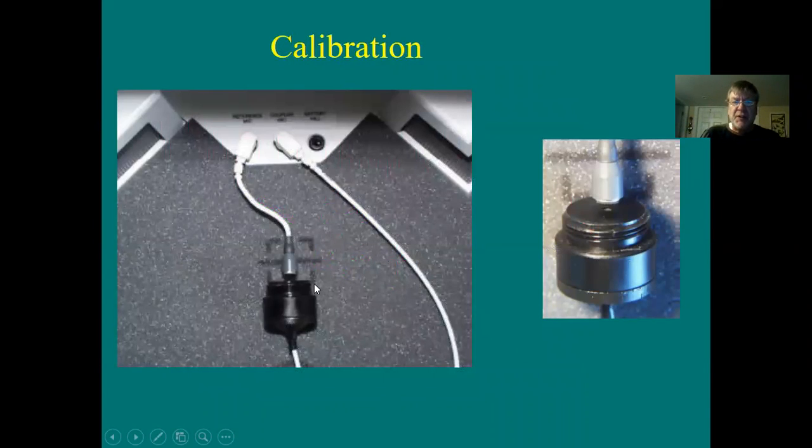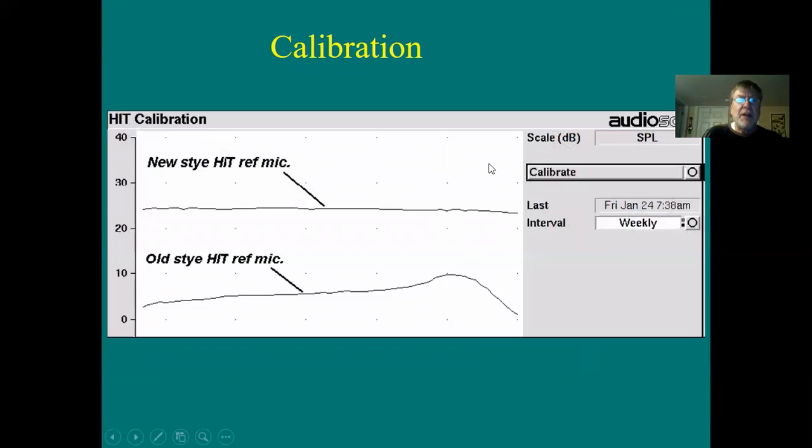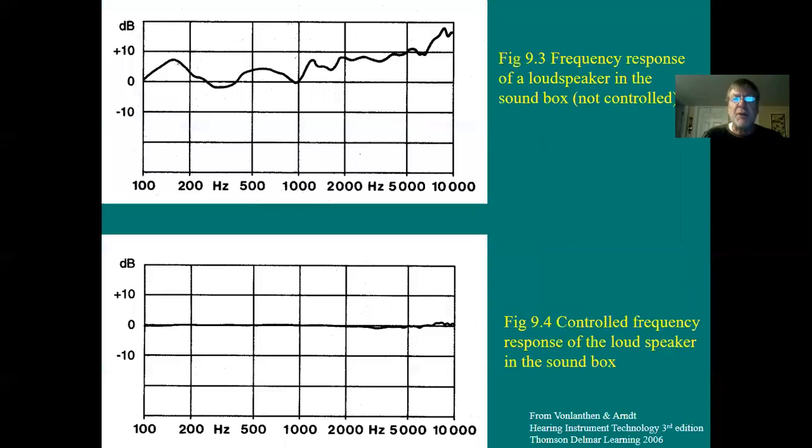You're going to see, so this is a close-up picture of that. Okay, every equipment's a little bit different, but basically calibration is the first thing you do with ANSI testing in the morning. And you put your reference mic next to your coupler mic and you hit the button, go calibrate. Calibration is going to look different on every piece of equipment, but you'll learn when to know that it's correct. Don't worry about this slide, it's kind of boring.